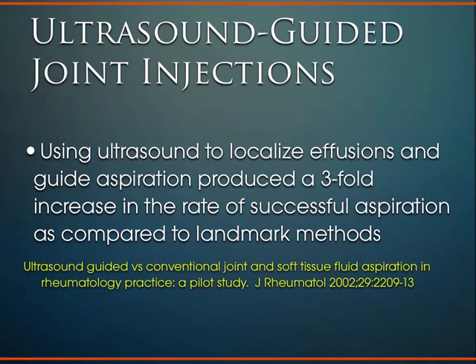But it's fairly blind, and you'll realize once you start using ultrasound guidance to do injections, and then you have to go back and do blind injections, which I had to do after fellowship, it's a little unnerving, because now all of a sudden you can't see where the needle is, you can't see where you're going, and ultrasound is very useful because, again, it's real time.